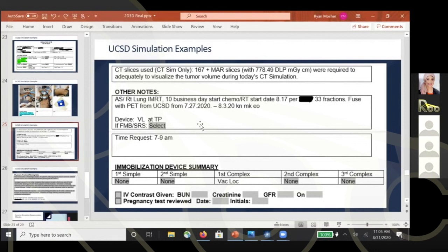One of them is called MIM, and I forget what it stands for, but that software specializes in fusing images that weren't in the exact same position. Yeah, I work on it. It's really marvelous. MIM, yeah, that's what we use.